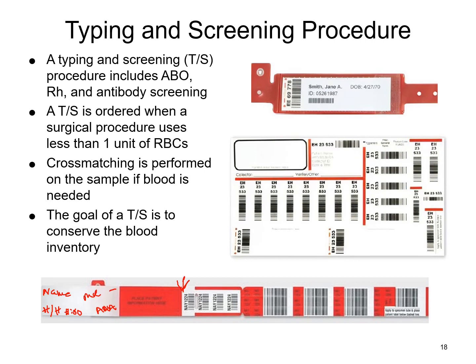And then you're actually going to get a strip of these numbers that will come with that tube, so that anytime you cross-match an actual product, you would peel up one of these barcoded stickers here and put it on that unit of blood as that extra identifier. And that allows you to actually do the barcoding. So the nurses, if you've got computer cross matches, are going to do the barcoding once they get ready to issue that unit. They'll barcode that bracelet on that patient and then barcode that unit number as well, making sure everything matches.